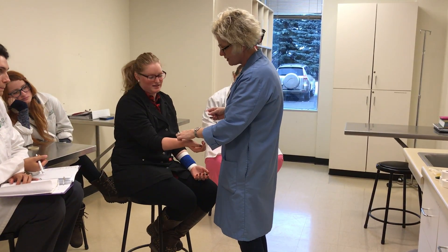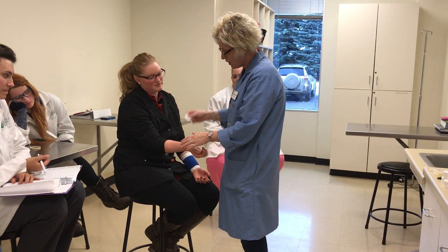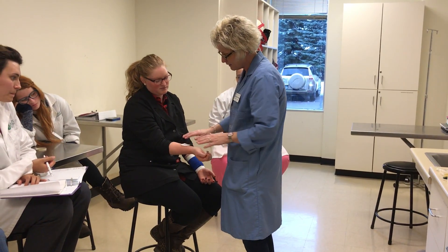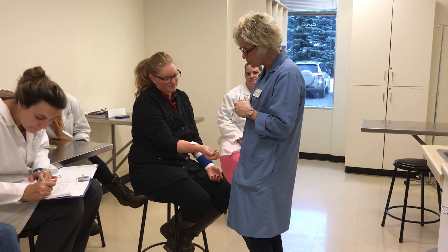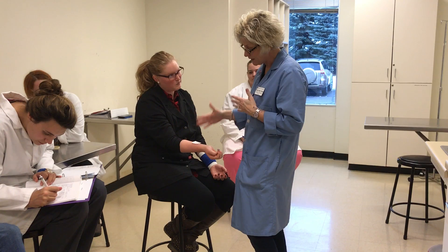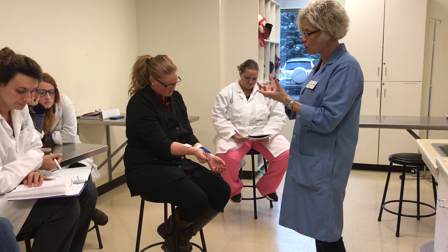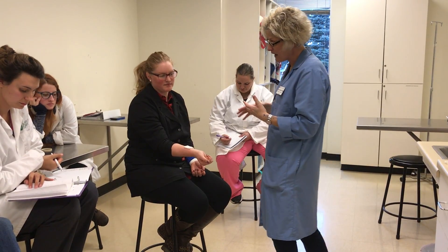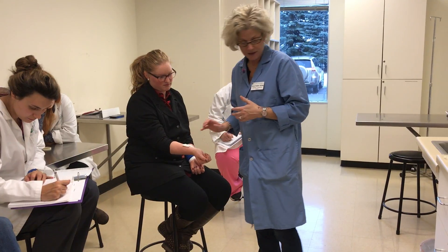We have a dewclaw here which we've removed surgically. We are going to provide a primary layer to our wound — that incision that is all sutured up — that contact layer. Here I put the Telfa pad because it will nicely absorb any drainage from this incision, and when we do remove this bandage it's not going to stick or upset that clot.